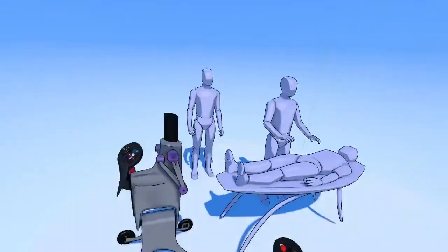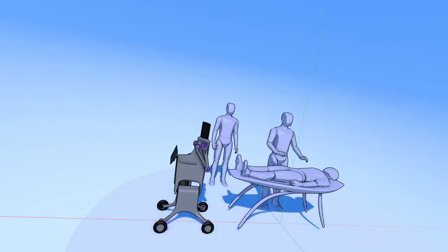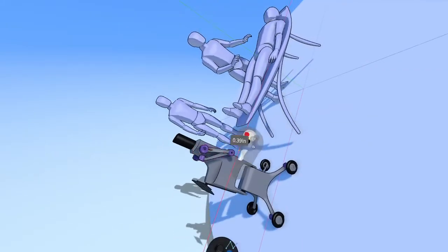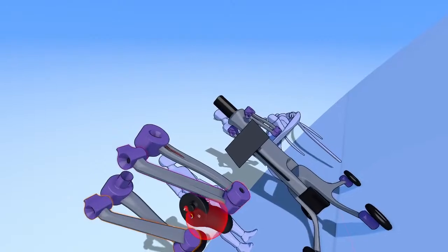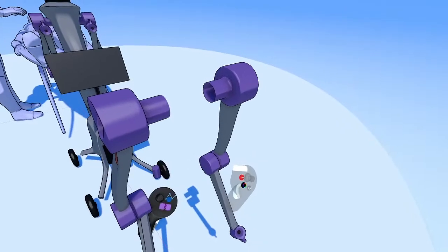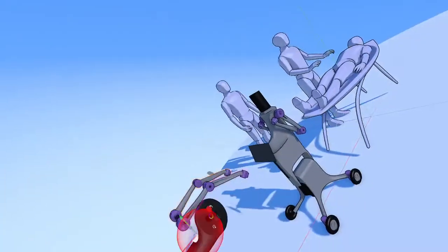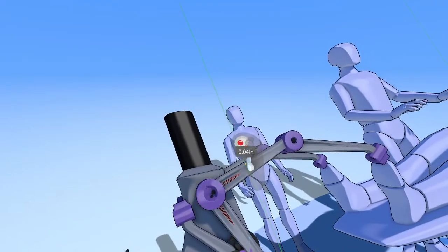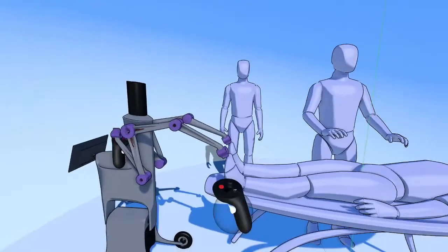All right, so let's see if you guys have any questions, and then I think this is probably a good part to wrap it up today. I'll do one last thing where I group the arm together, duplicate that out, and okay, so this is a really bad way of simulating what the pivot points are going to be, but I'm just going to drag and rotate it out like that, and then regroup it, and then spin it like this. So we'll see how far these arms can actually extend. I mean, it's not the cleanest thing in the world, but it does a good job. So now we can see that this can very clearly just cut off this guy's feet.